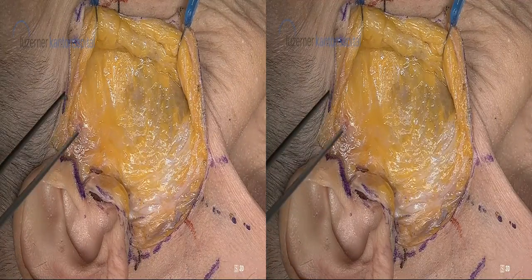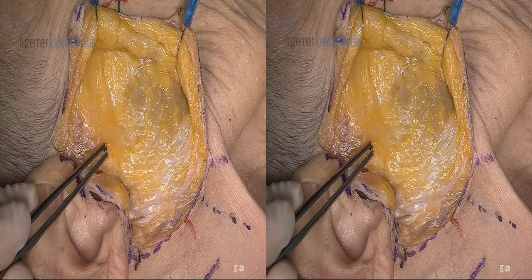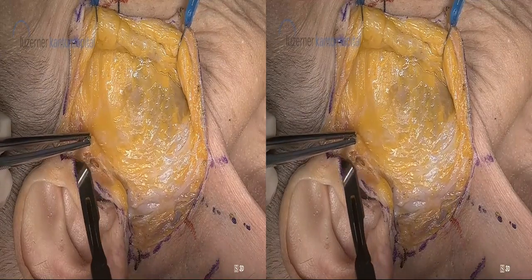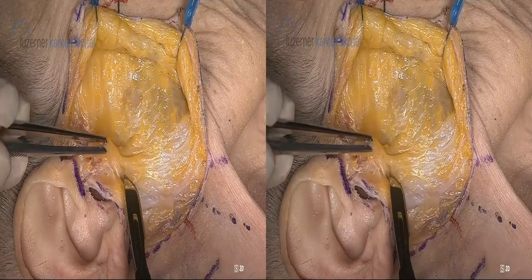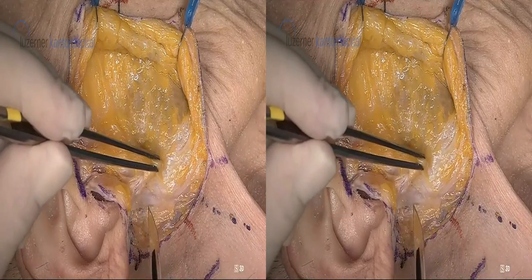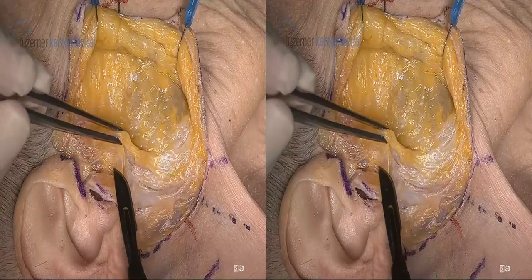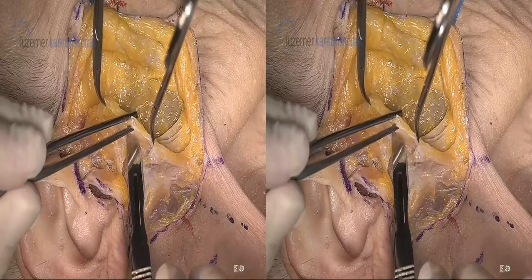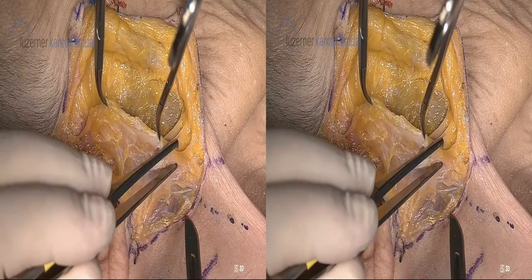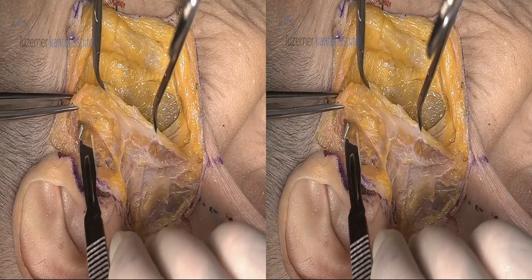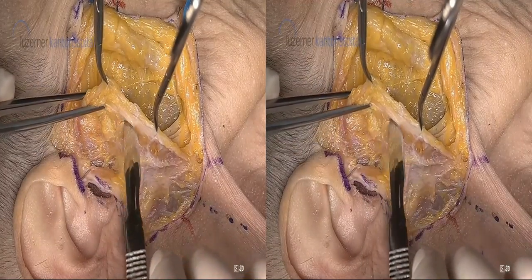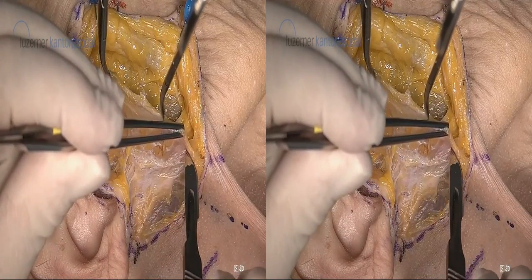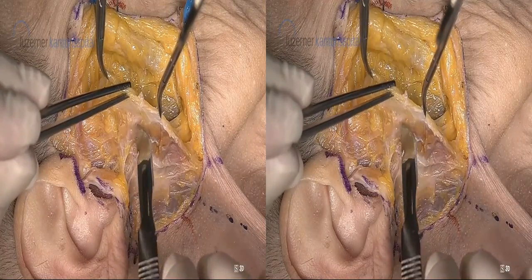Next, we will develop the SMAS flap. The SMAS flap is actually part of the subcutaneous tissue, parotid capsule, and then anteriorly the platysma. So we have to find the plane between the actual parotid. This is very helpful, especially in tumors where you need to dissect a lot of tissue. You need to place small clamps on that border. You see, I already hear parotid — this is already a little bit opened, parotid tissue. It has been said that this SMAS flap will avoid Frey's syndrome later on in parotid surgery. That is not true. This SMAS flap will delay Frey's syndrome and will make it probably less severe, but it does not avoid it, unfortunately.